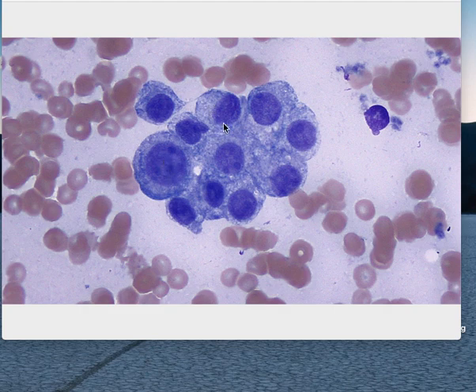Look at their chromatin pattern in their nucleus. Look at the cytoplasm. Okay, they're all different in size and sometimes in nuclear cytoplasmic ratio, but they are the same cell type with different sizes. This would lean us more towards a neoplasia. It is not our job to call this, but clearly this is not an inflammatory lesion as much as it's leaning more towards neoplasia.